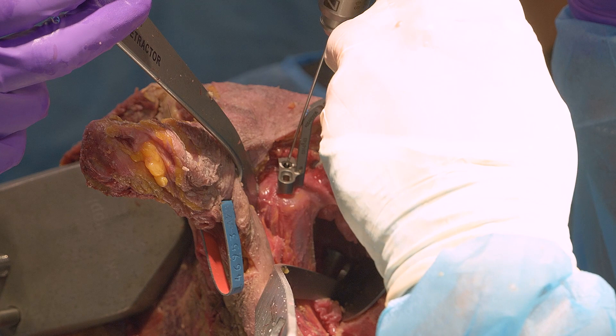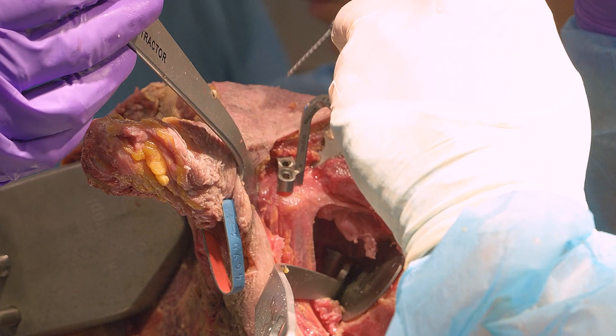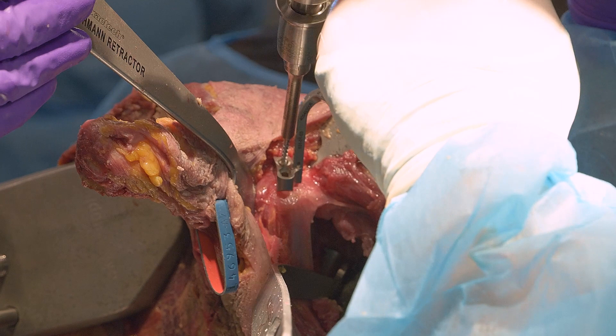As a surgical tip, I use a K-wire to drill a pilot hole in the coracoid to ensure I'm in good coracoid bone prior to screw placement. Typically the lateral screw goes in first, followed by the medial screw. However, as a surgical tip, I prefer to put the medial screw in first to make sure I'm in good coracoid bone with good fixation. It also prevents a well-fixed lateral screw from being pulled up by a better-fixed medial screw. Here I'm putting the medial screw in first — in this case, we had adequate bite — and then secondly the lateral screw.